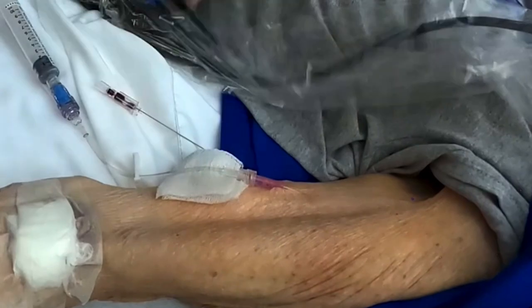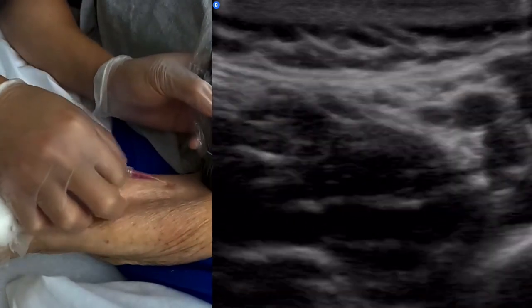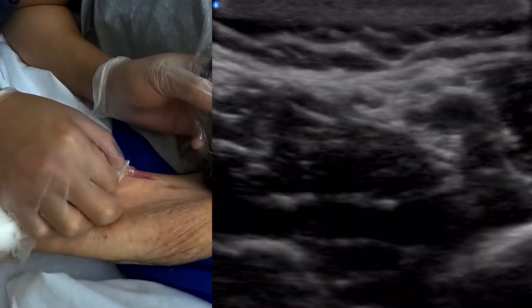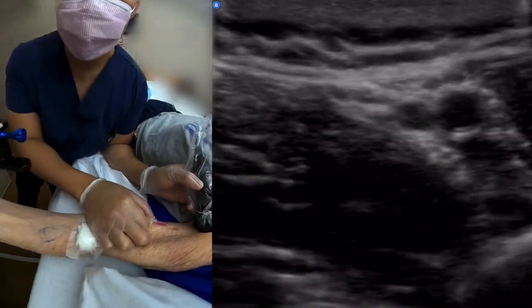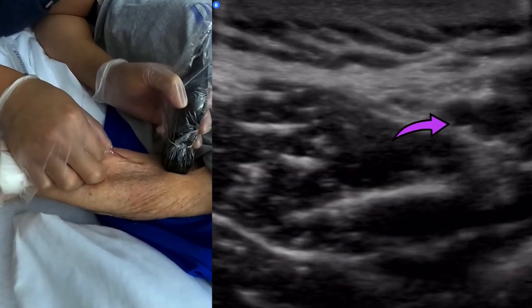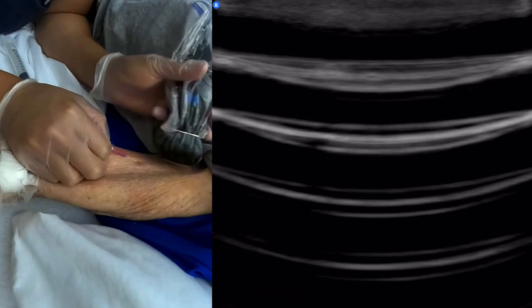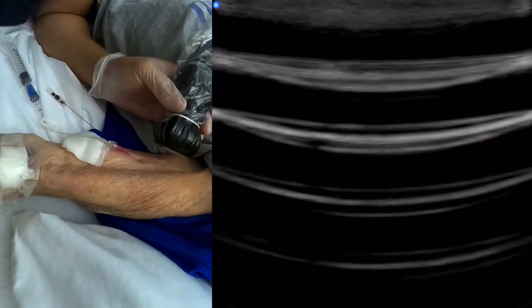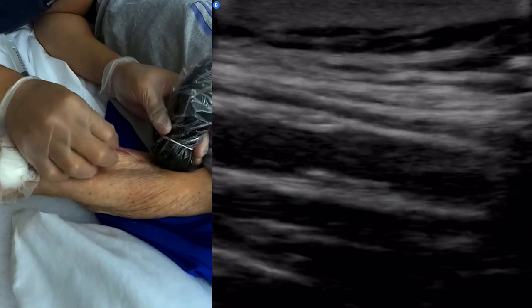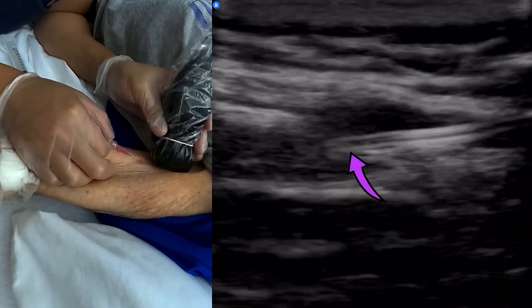So let's see what happened there. See where that catheter is lying. So there's my catheter there. And let's see what's happening here. All the way to the end. There's the catheter. There it is. There it is at the tip. And this is where the benefit of gel would be granted. Okay, now I'm gonna try to advance.